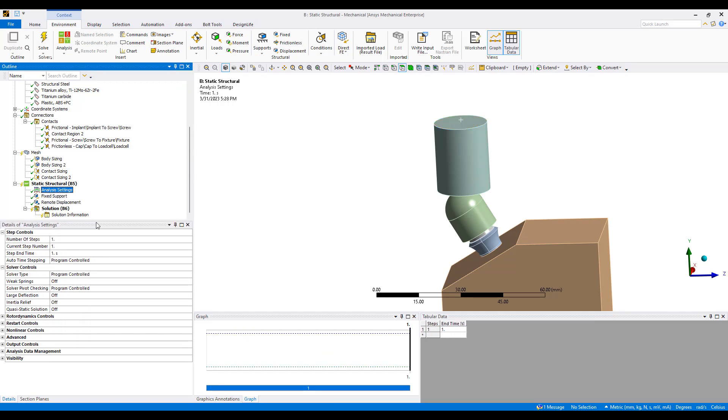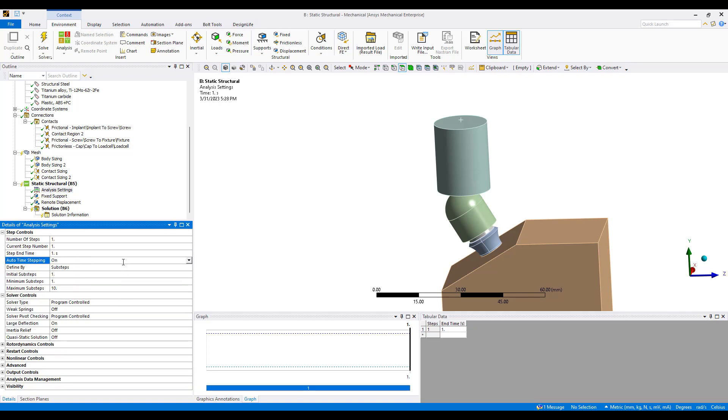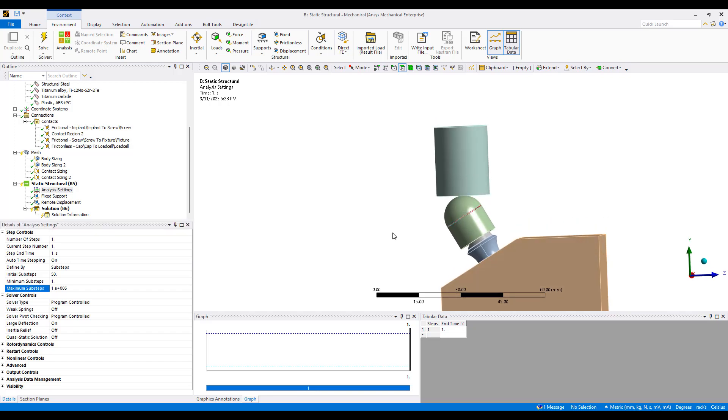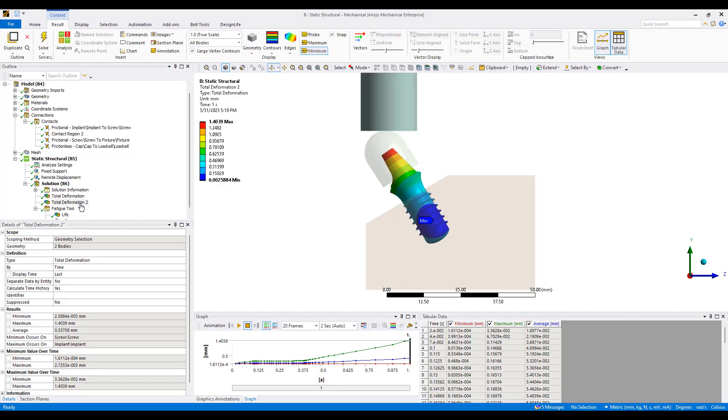It's a non-linear analysis. We want to turn on large deflection and we want to turn on auto time stepping. Usually I start with maybe 10 or 100 so maybe 50 here and usually 1 into the 6. This allows ANSYS to dynamically adjust the amount of load it's putting on at each point to calculate so that we get a converged solution.